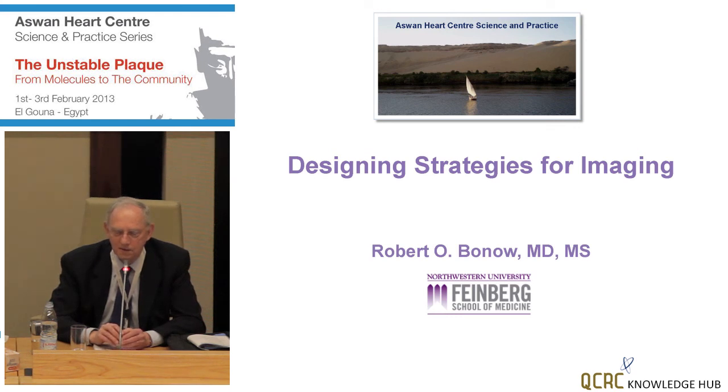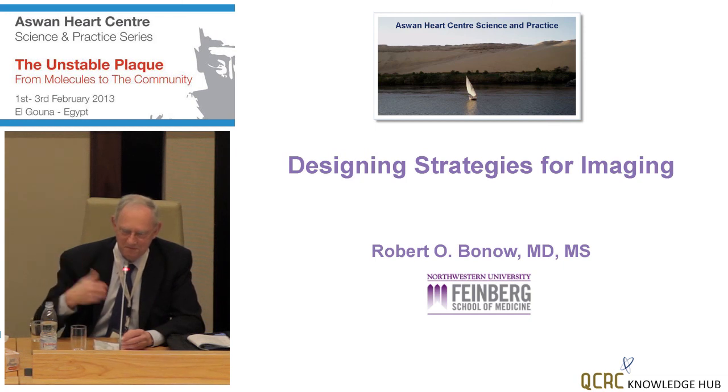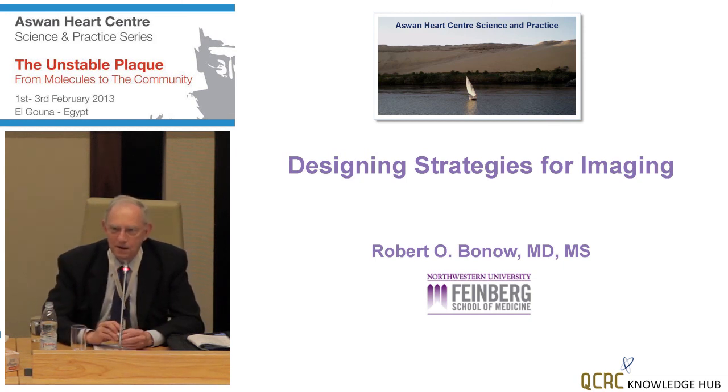And so I think the intravascular imaging, in my view of the world, is helping us understand the physiology and pathophysiology of what acute unstable plaques do and why they rupture, and also identifying the frequency with which plaque erosion occurs, because plaque erosion can also be visualized with OCT, as you point out, where it cannot be visualized well with intravascular ultrasound.